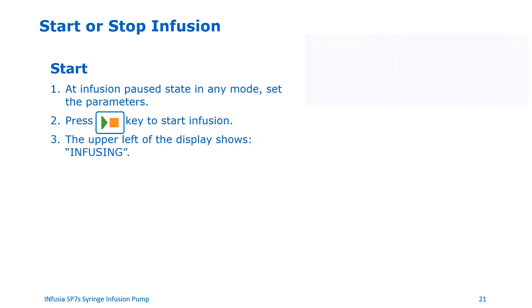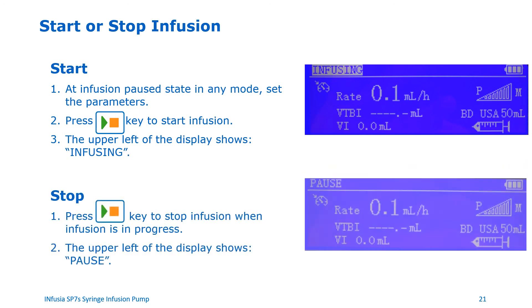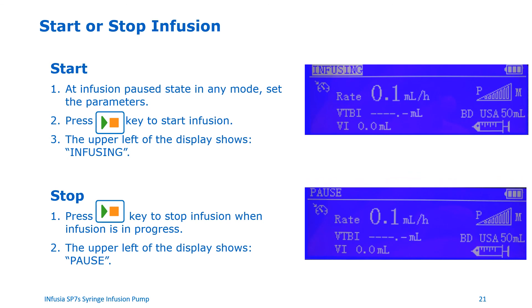Starting or stopping the syringe pump. To start the syringe pump, once you have set up all the parameters for your infusion, press the start pause button to start the infusion. The pump screen will show a status of infusing on the upper left part of the screen. To stop the syringe pump, when the infusion is in progress and you need to stop the infusion, press the start pause button to stop the infusion. The pump screen will show a status of pause on the upper left part of the screen.